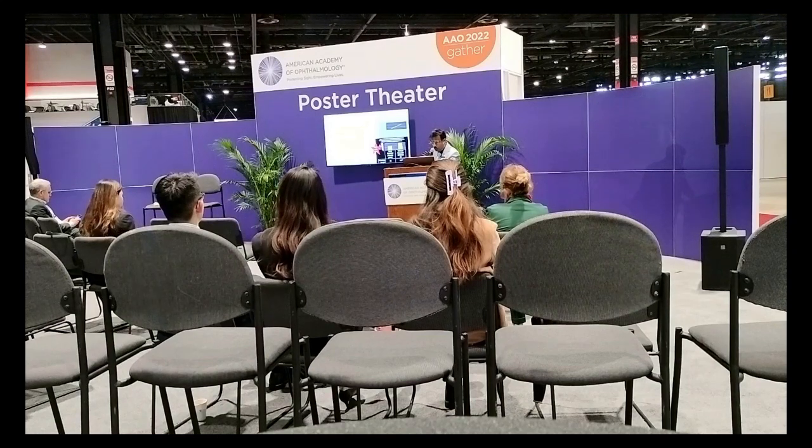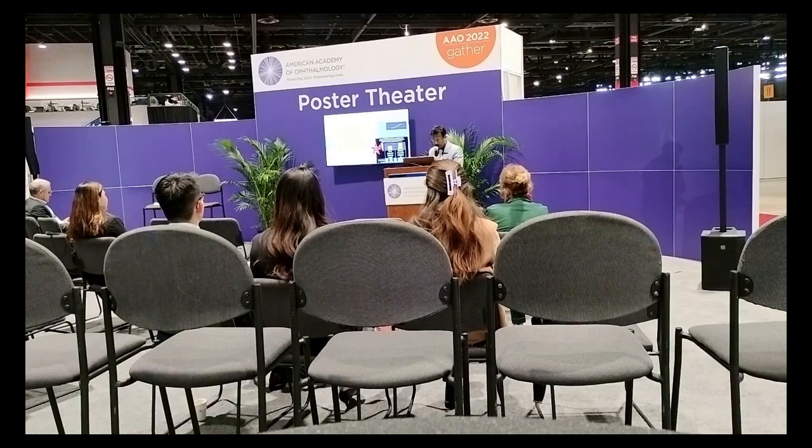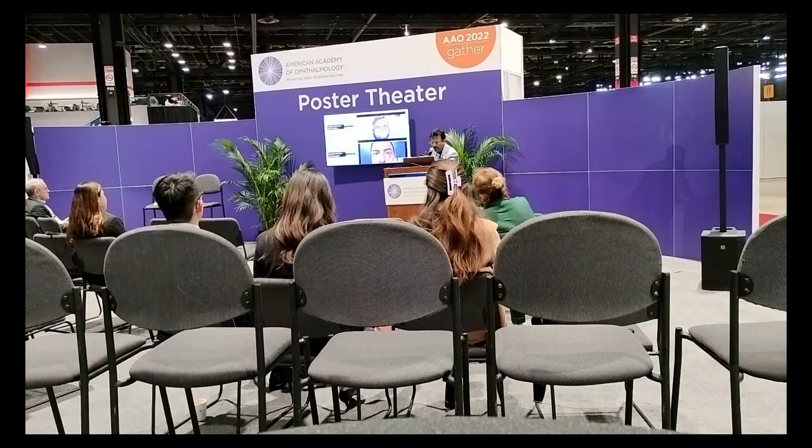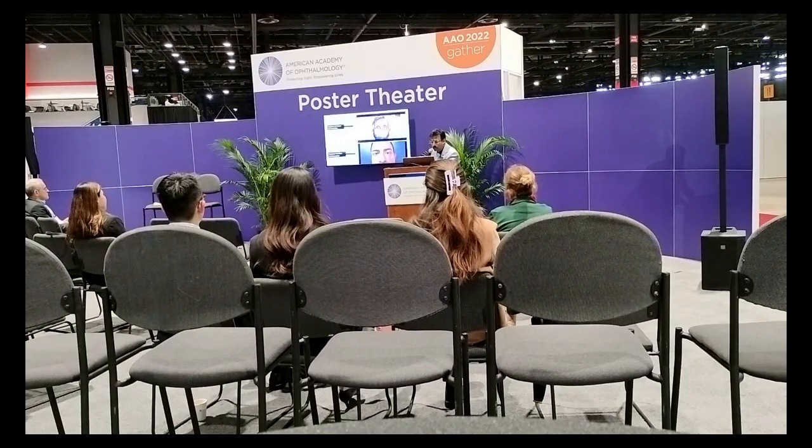Cosmetically the look is better, and rehabilitation is much better. We had good results in all the cases. There were no such complications. Now, first to see how to calculate the area. This is the ellipsoid area, where A is the surface area, A equals pi times a times b, where pi is 3.14, a is the long axis expressed in millimeter, and b is the short axis.